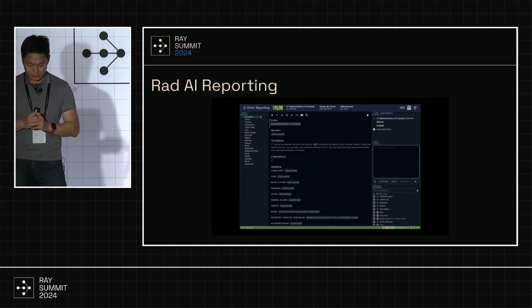Bibasilar atelectasis, period. Distended appendix measuring 11 millimeter with adjacent stranding but no abscess, period. 2 centimeter hemangioma in segment 3 of the liver, degenerative changes in the spine, period. 3.7 centimeter right renal cyst, period. 5.3 centimeter left ovarian cyst, period. Splenic granulomas, period. Status post cholecystectomy, period.